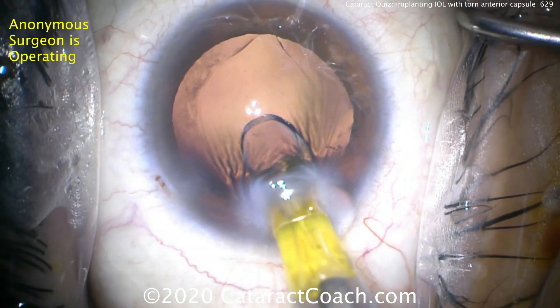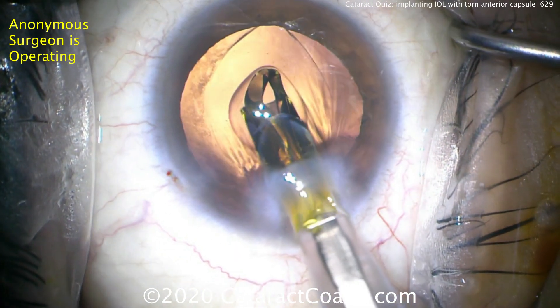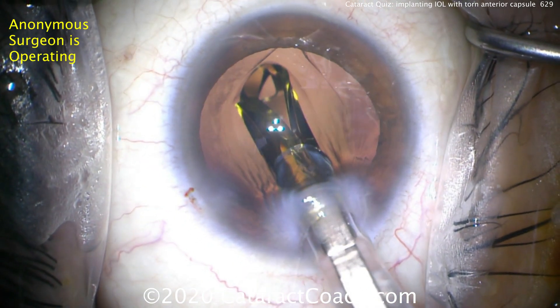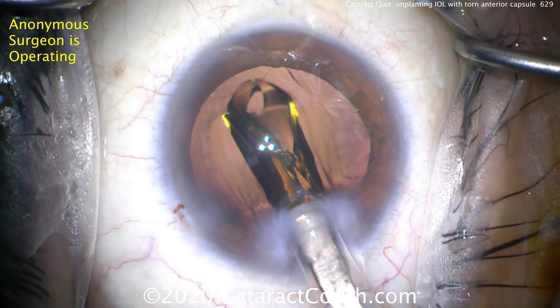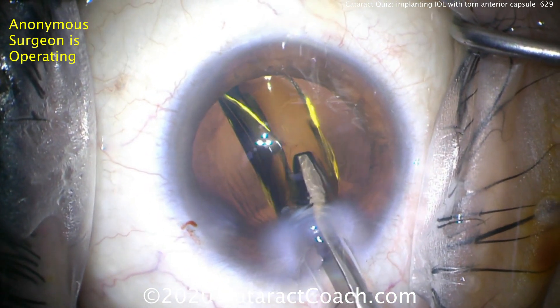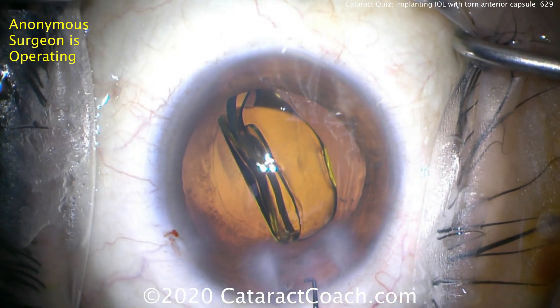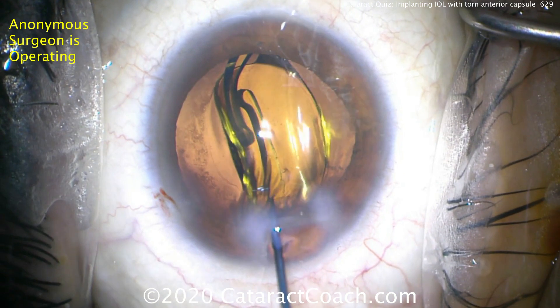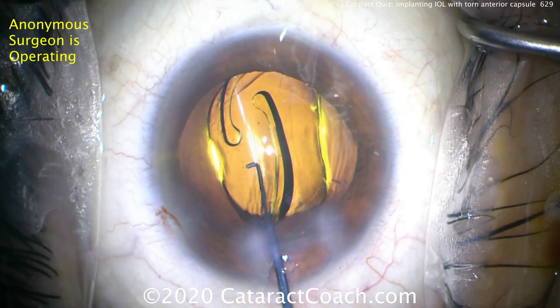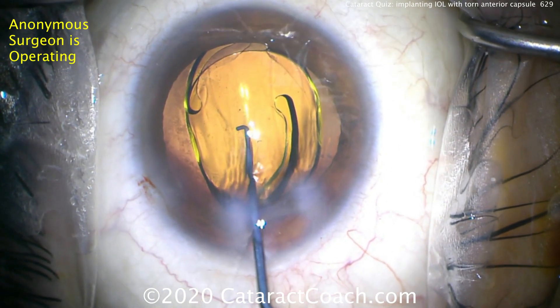Here comes the IOL — a single piece acrylic lens we're going to place in the capsular bag. The key here is to be very gentle in its placement. Make sure the lens is loaded into the injector correctly. This looks good. Get it into position and don't cause any stress to the capsule. Very gently get the haptics to open up. You can rotate it as well to get the haptics away from that one area.